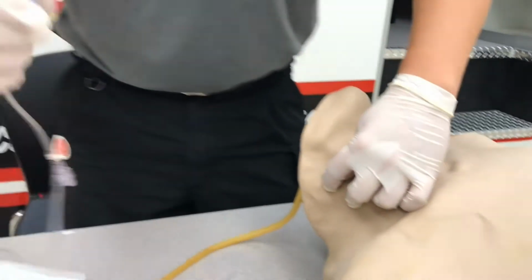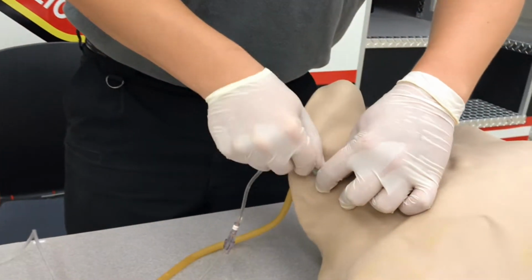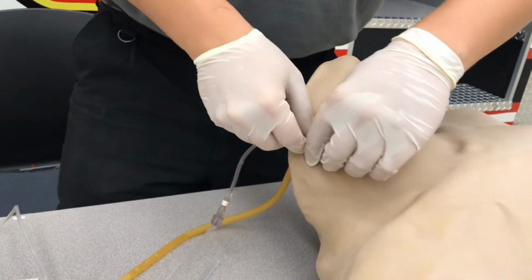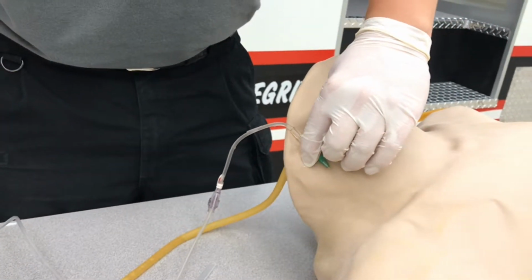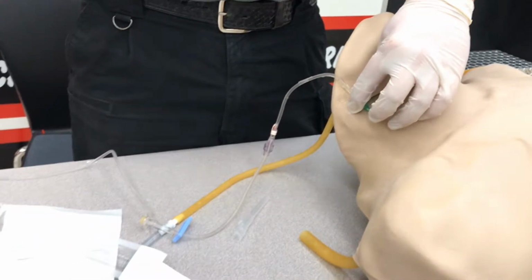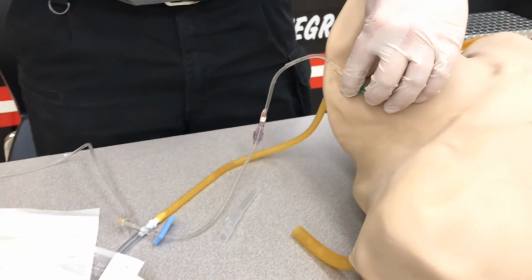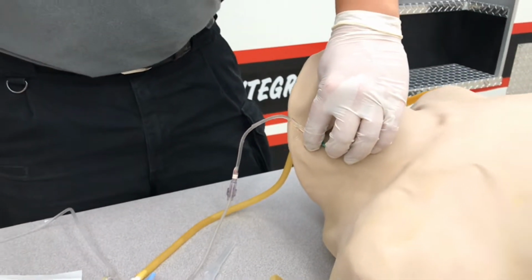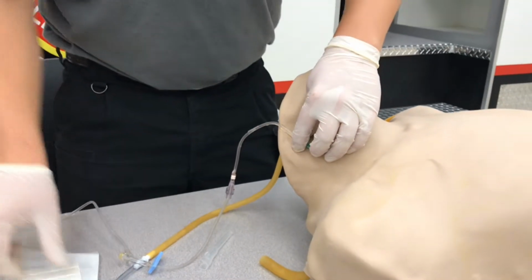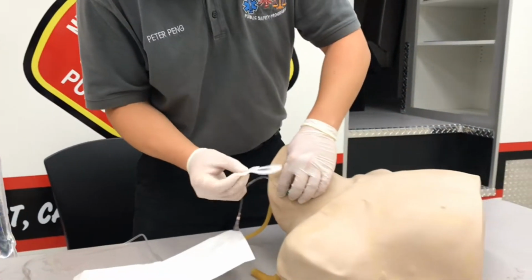Now we'll attach our IV tubing here. Secure it down and open it up. And we're going to check to make sure that we have good flow, and we do. I'll put that down to TKO, and we'll secure this down with the Venous guard.